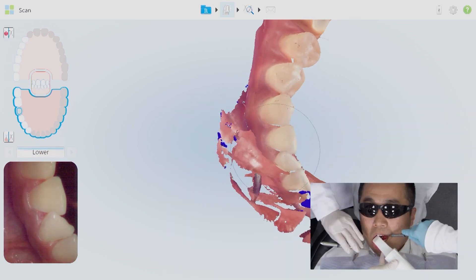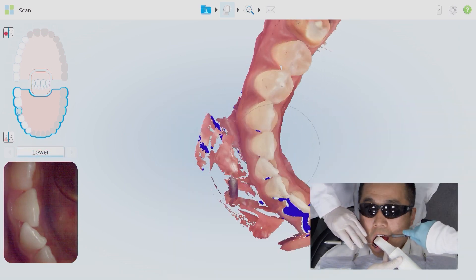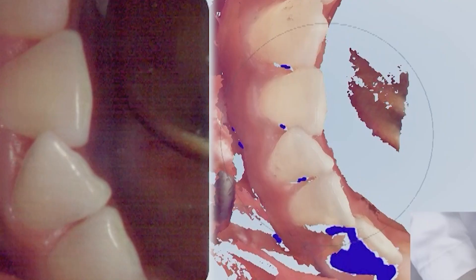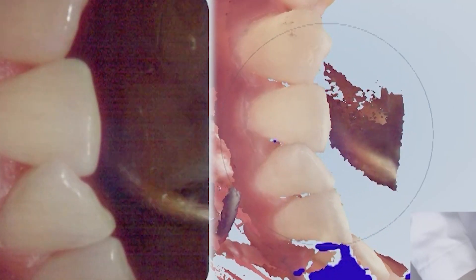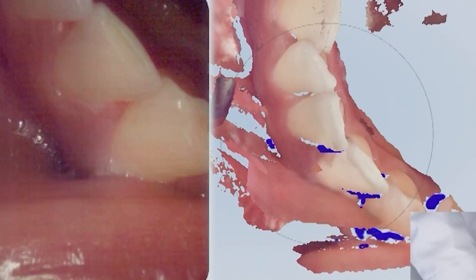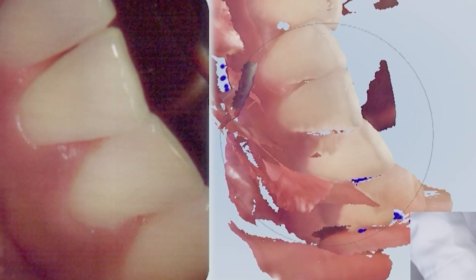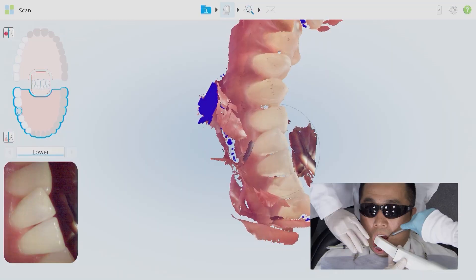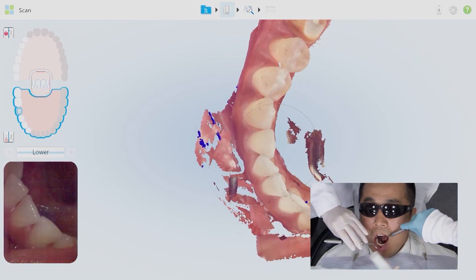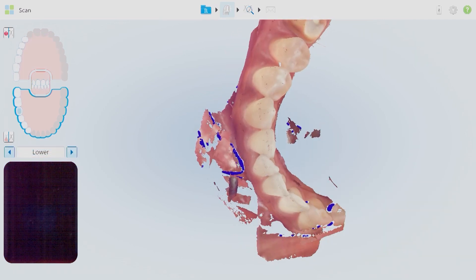Once you rotate to the facial, you start off at the incisal and then slowly build in those facial areas. That will allow the system a chance to build those areas in correctly, instead of just going straight to the facial without it really understanding how to align that data.